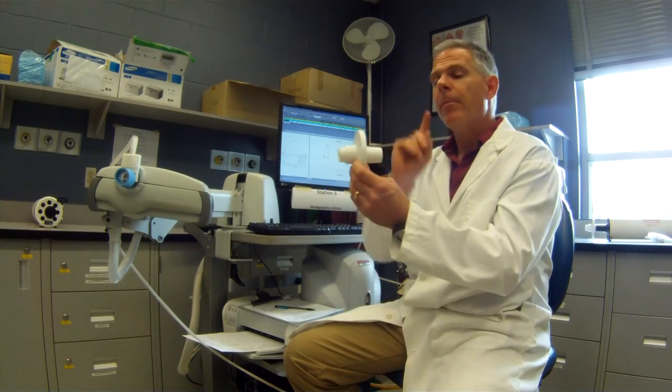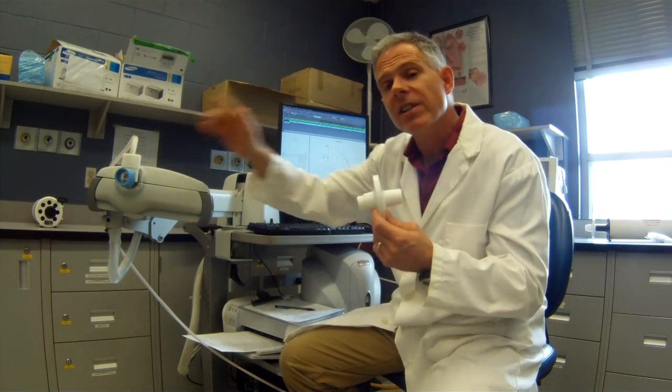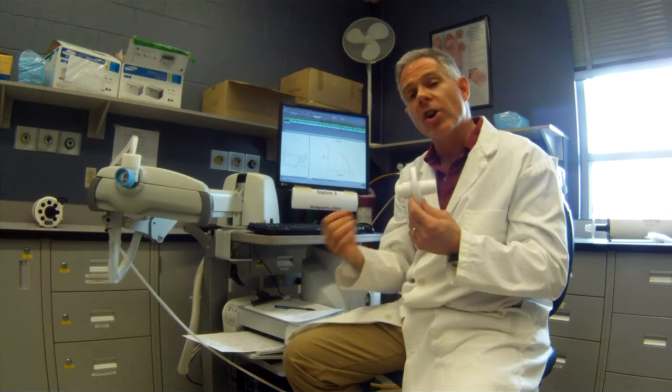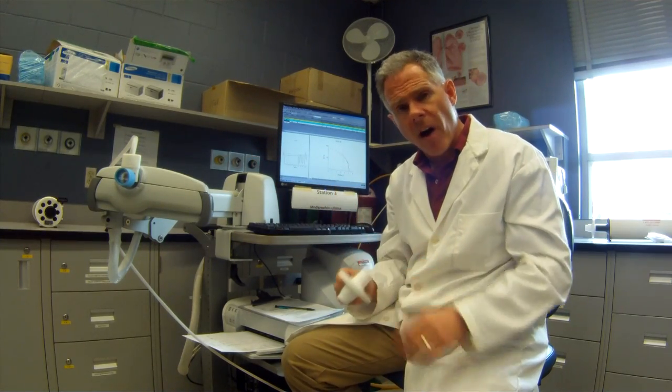All right, so start off with nice, even breathing, no changes, but they will notice, and you must tell them, that they're going to be breathing this unusual gas. It's just oxygen, but it's going to be dry and make them feel a little bit uncomfortable, and they're going to notice that they're breathing through this regulator. So it's going to feel and sound a little bit odd, all right? But no change in breathing patterns.